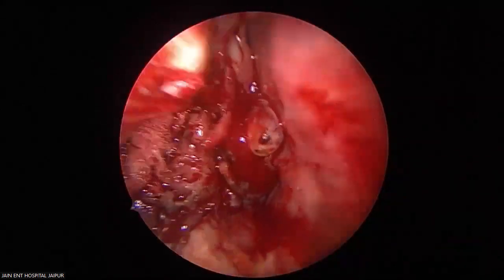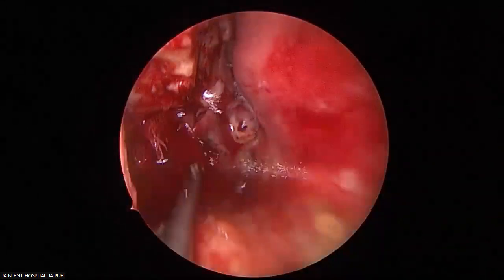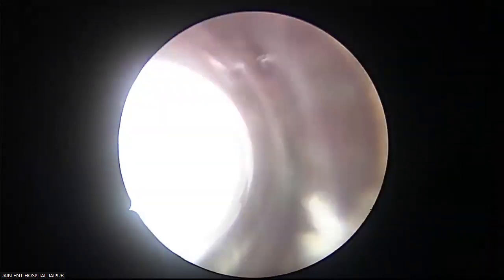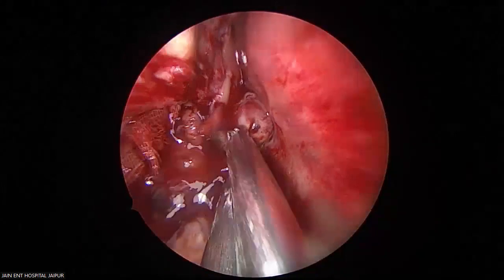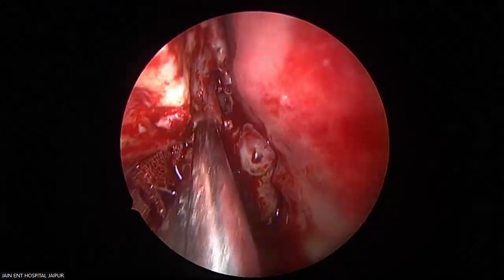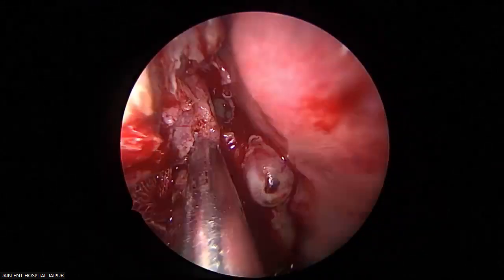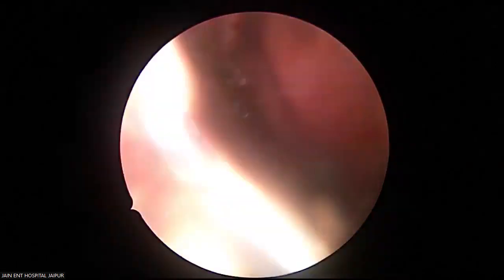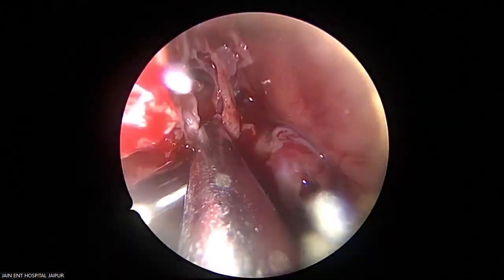Like this. And then we'll go in the ethmoids and the sphenoids from above. Quickly. This is ethmoidal dissection. Your lateral limit is the lamina papyracea.